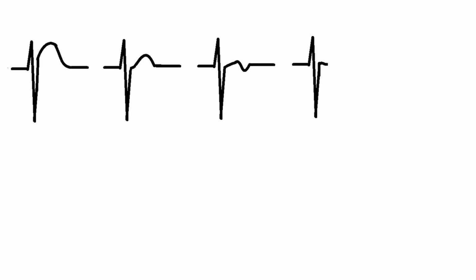Usually, the ECG pattern of Wellens syndrome appears after a transient ST segment elevation in the precordial leads due to sudden occlusion of the left anterior descending artery. If spontaneous clot lysis occurs, the ST segment descends to the isoline, but a biphasic or inverted T wave appears and pain subsides. If coronary perfusion is unstable, pseudo-normalisation of the T wave occurs. In this case, the T wave becomes positive during re-occlusion.